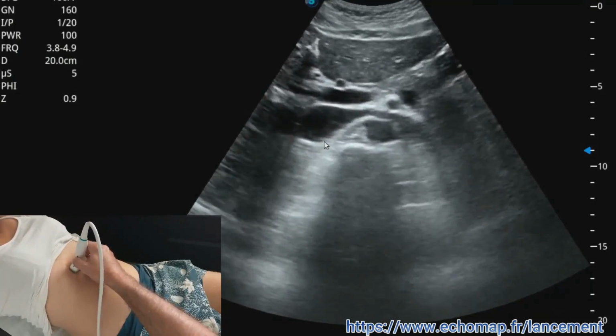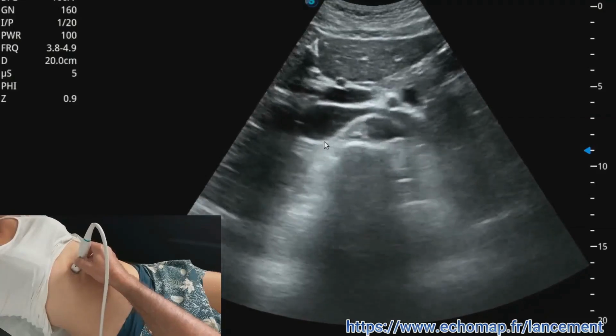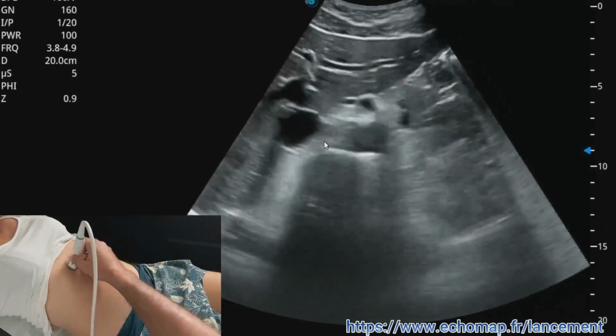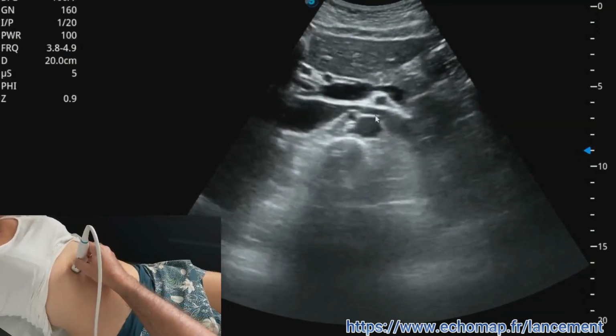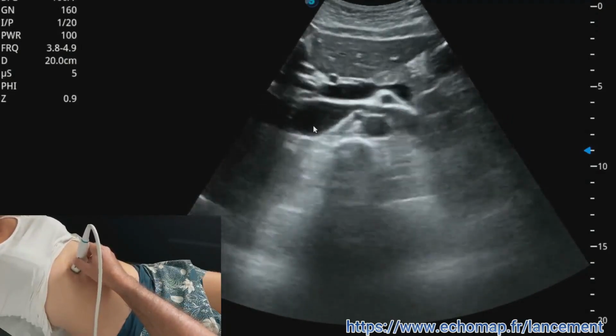And the great thing is at the epigastric level, that's why I'll ask you to start there. And don't start by putting your probe directly on the patient's belly, because at the epigastric level, you have the hepatic window and it always goes through fine. Your ultrasound is always going to come through well at this level, so you won't have any trouble spotting large vessels a little bit.